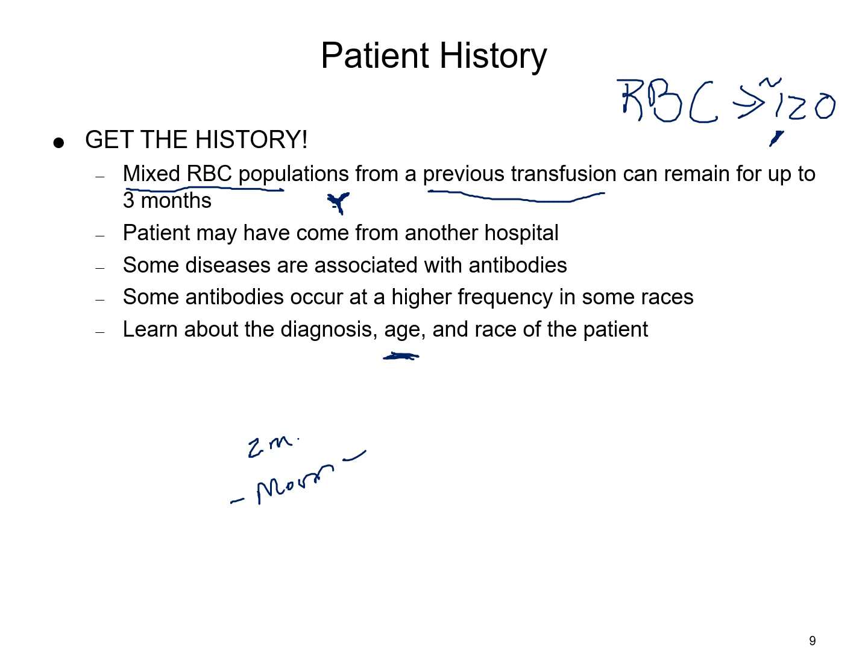Also, that elderly population, remember, they have those weaker expressions of those antibodies. So sometimes if you are testing a patient that's elderly, and you're getting weak reactions, that could help you understand why those reactions are weak.